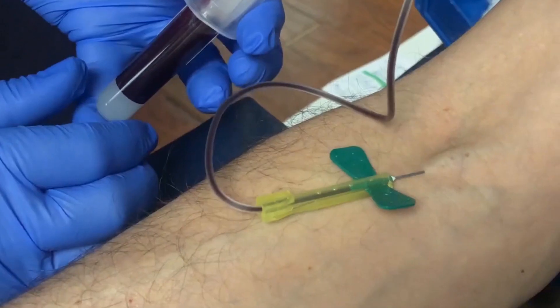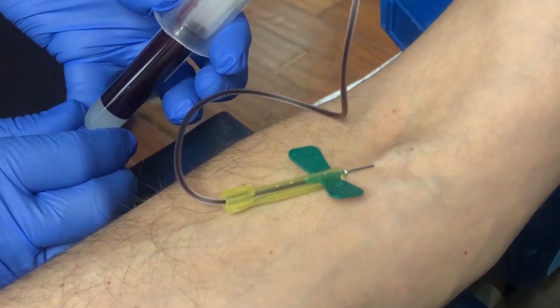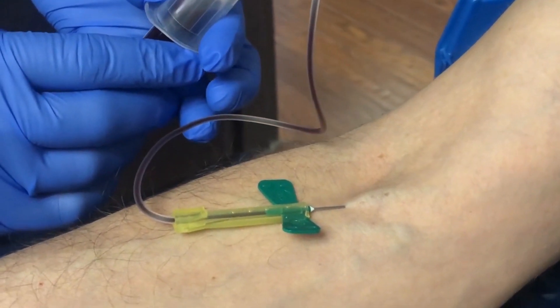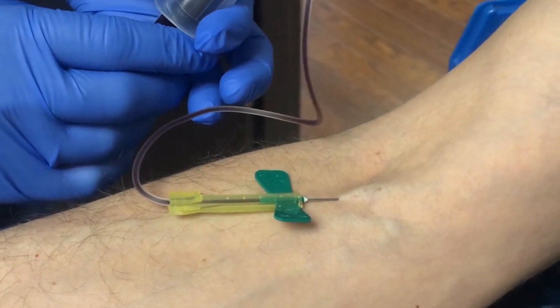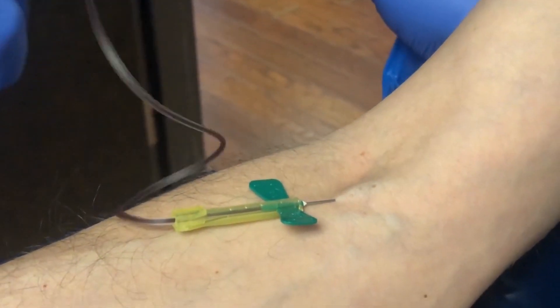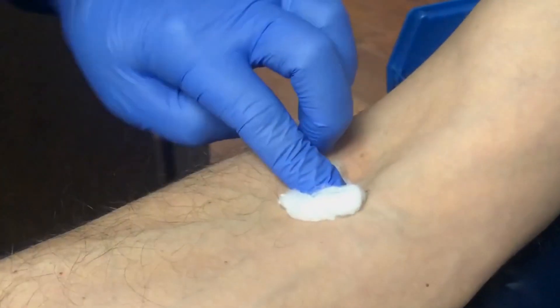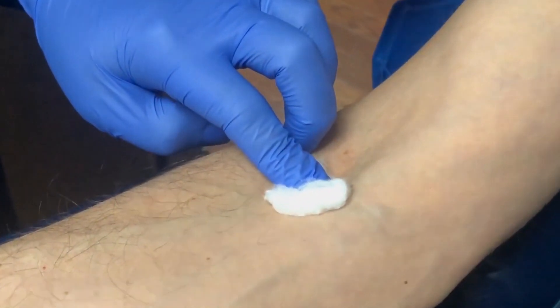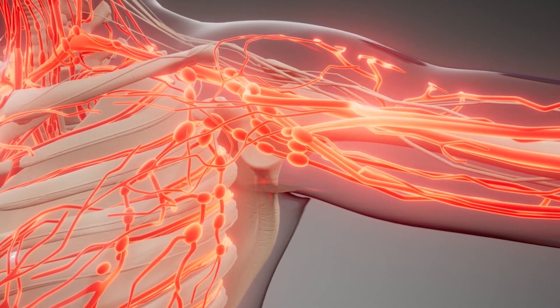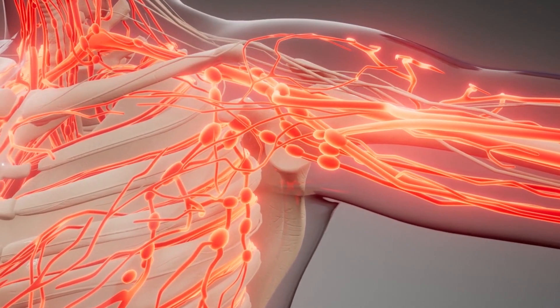Push the needle with the bevel facing up firmly and deliberately into the vein. If the needle is in the vein, blood will flow freely into the tube until the vacuum is exhausted. If no blood enters the tube, probe for the vein once or twice until entry is indicated by blood flowing into the tube.